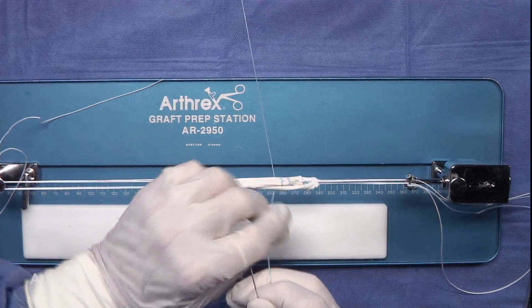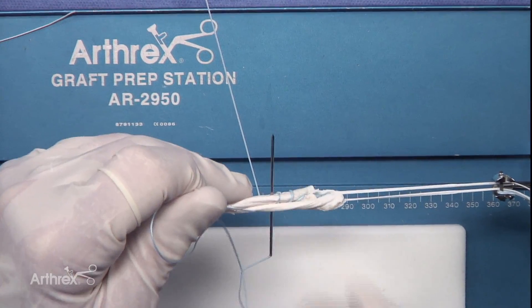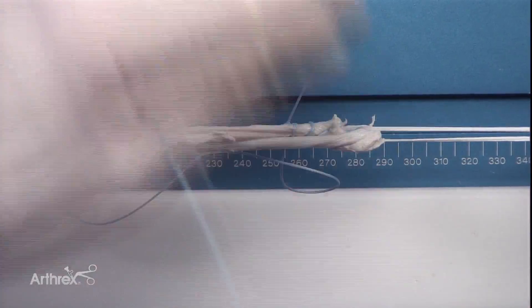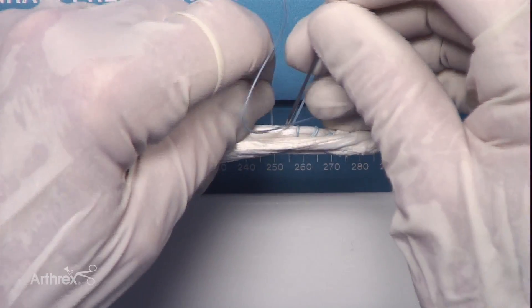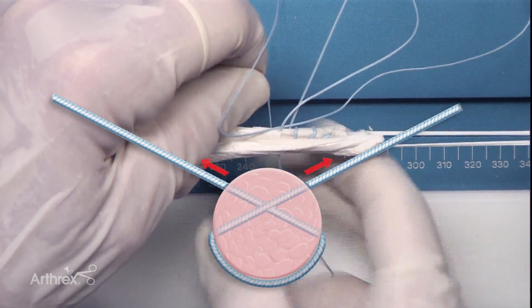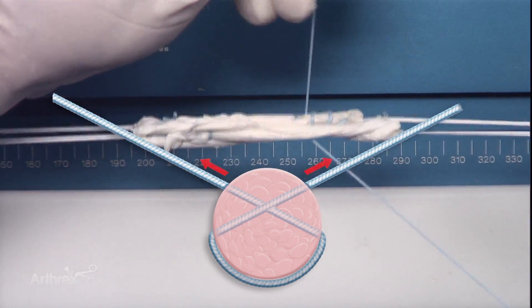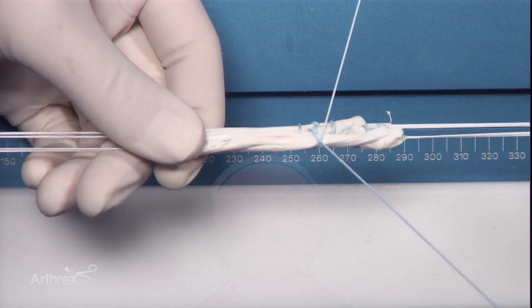We're going to pass that forward. We're very simply passing these perpendicular to the graft, forming a loop. We're going to cross it over.